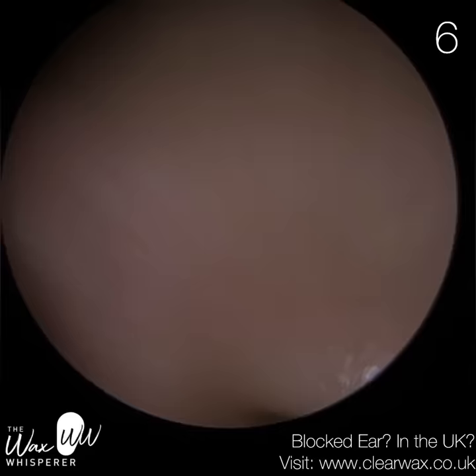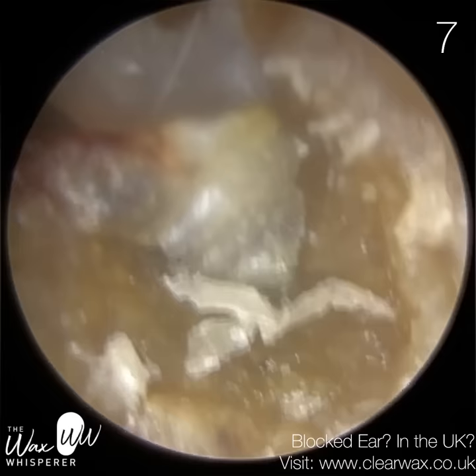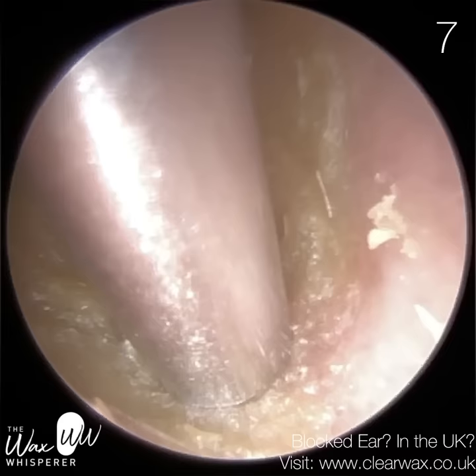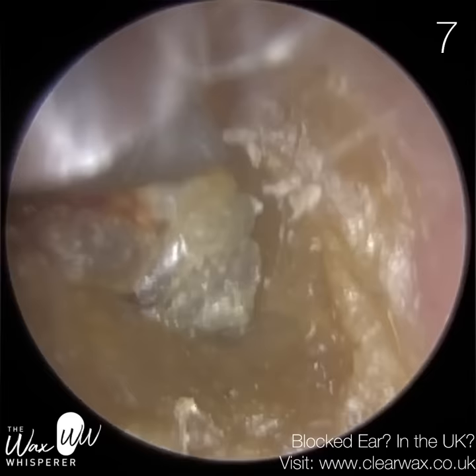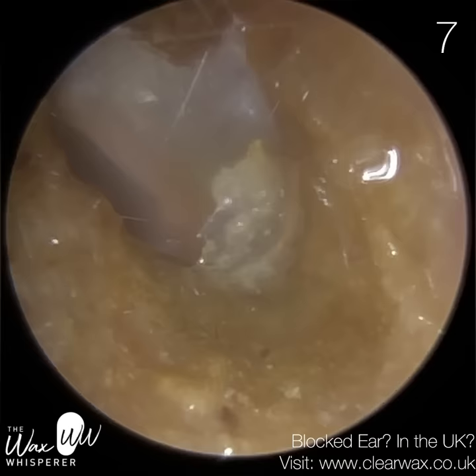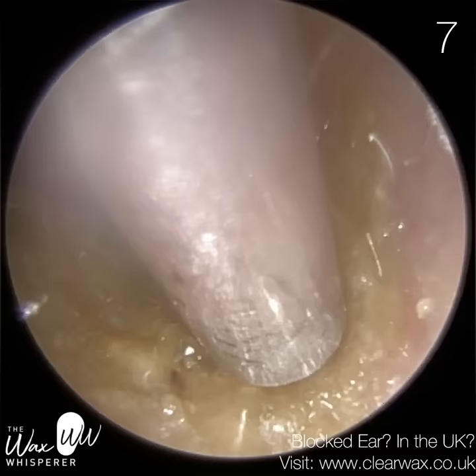Patient seven has a collapsed ear canal entrance. The cartilage portion of the ear canal — the outer third — has weakened over the years; this is an elderly patient, and it's more common with elderly patients. The cartilage over time can weaken and collapse upon itself. It's why some elderly people also have droopy nasal tips — similarly, the lower two-thirds of the nose is made up of cartilage, and over the years the cartilage can weaken and gravity takes its effect, producing a droopy tip.